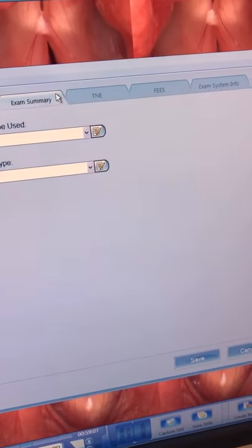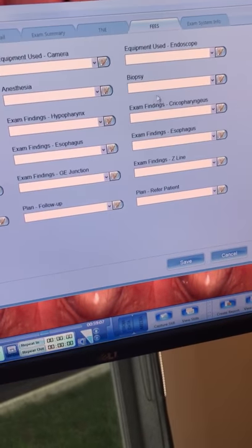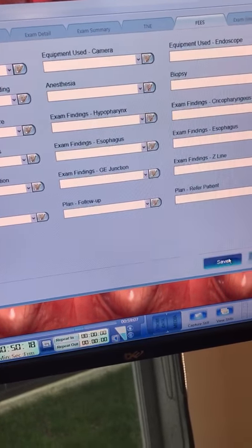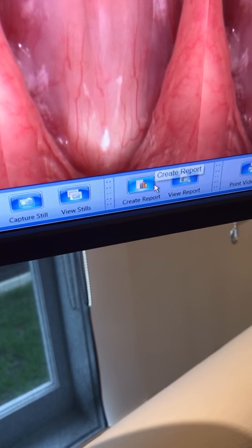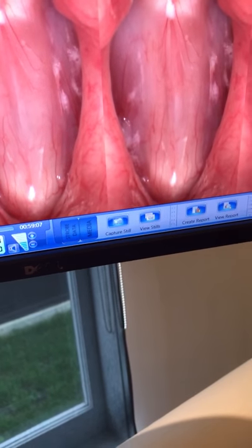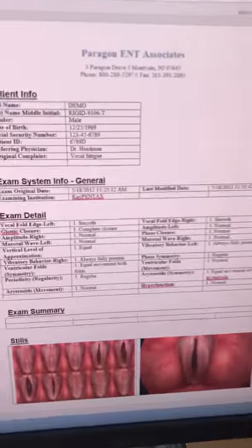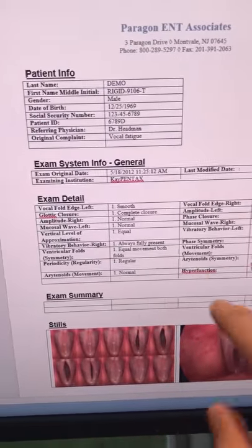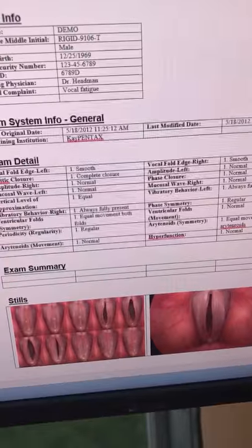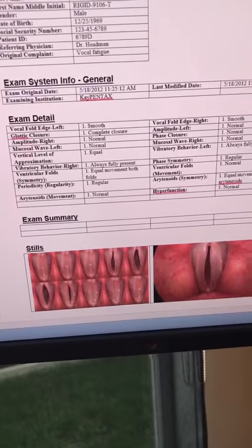So, exam summary — we've added a T&E one and a FEES one as well. Whenever you put any information in there, we save it. Then when we create this report, all that information comes up onto that report. So we just click view report, and in a few seconds this report — which has already been done — comes up as a Microsoft Word document, so it's all editable. We've got the exam details and summary, and all the photos that you've taken come onto there as well. That's pretty awesome.